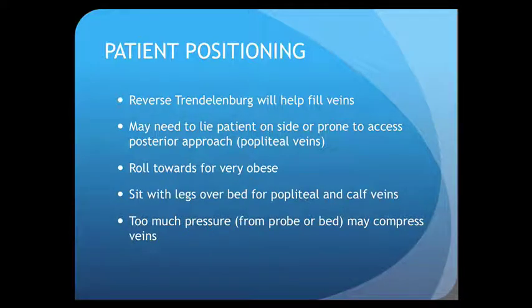Now, one of the things to remember though is you need some pressure in order to get nice crisp images, but if you have too much pressure, you'll actually compress the vein and then you won't be able to see it. And that can either be from the probe or even just from the leg resting on the bed when you're talking about the popliteal and the calf veins.